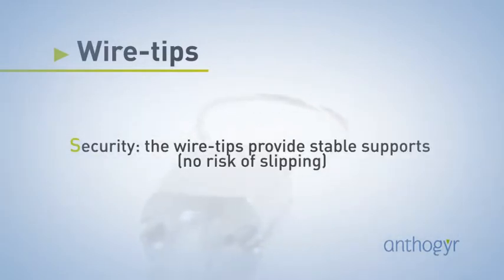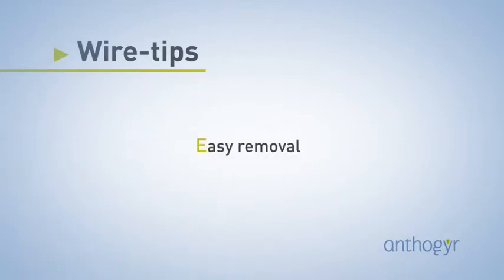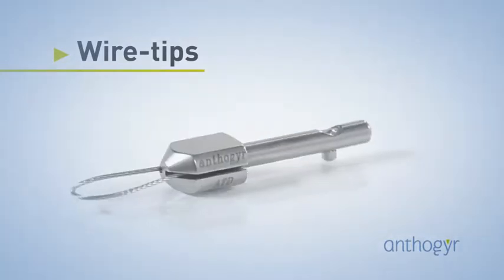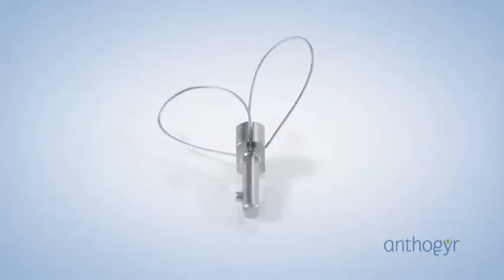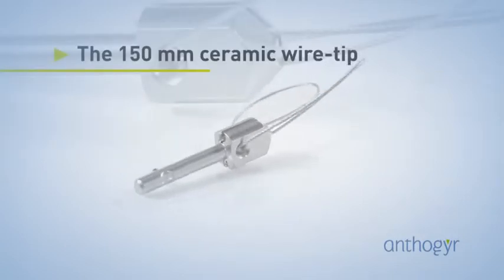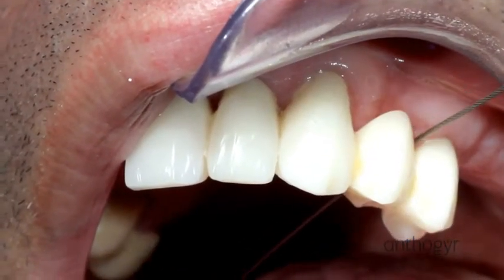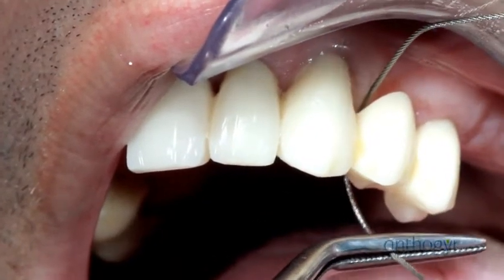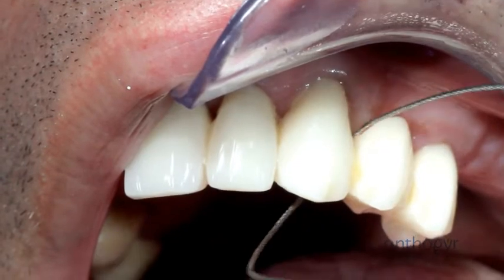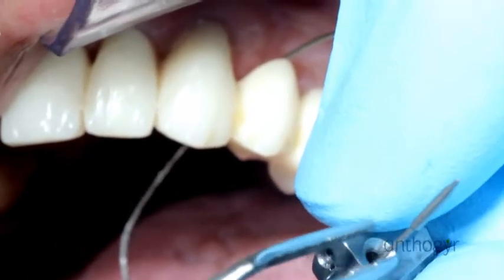In the following cases, the ATD technique, which is recommended for the removal of bridges, will be used. Specific inserts with cables are inserted in the interdental spaces resting on the basal surface of the bridge. These inserts may be single or double according to the width of the prosthesis to be removed. A 5-element anterior bridge will be removed from 4 abutment teeth. In this case, a 150mm double wire tip will be used. A 95mm cable is also available in the SafeRelax Complete Kit for removing bridges with 3 elements.